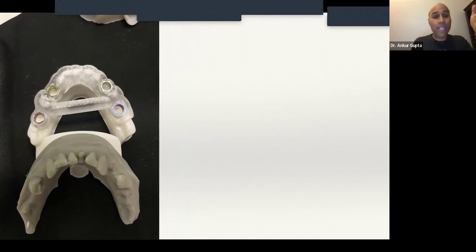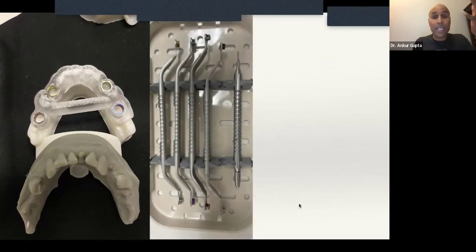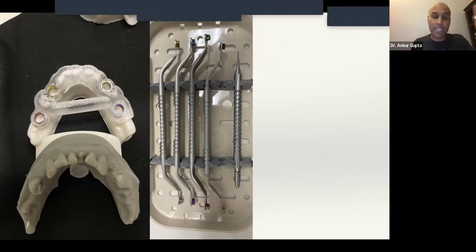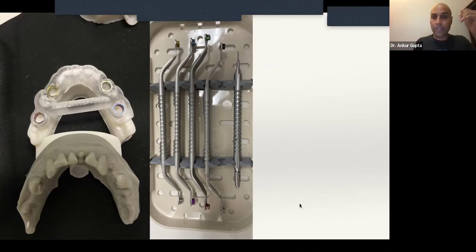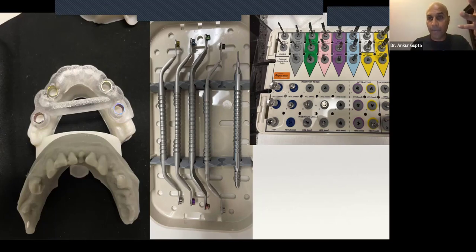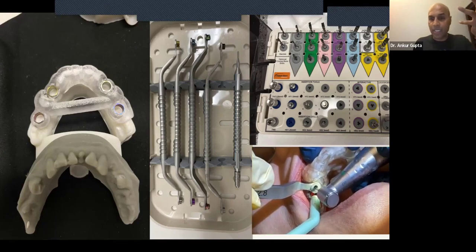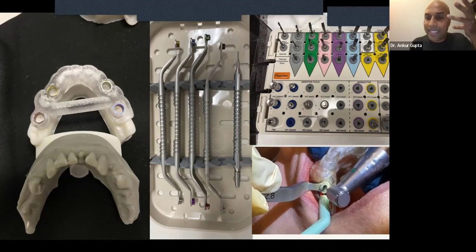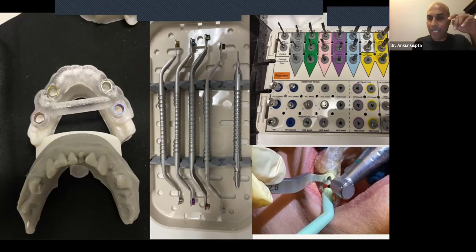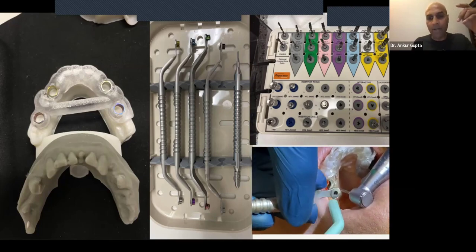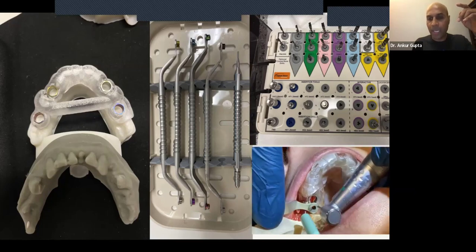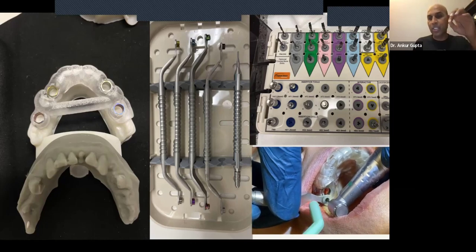My lab tech told me: before you get started, pull a couple of these teeth so the guide will actually fit. Then when you snap it on, this thing serves as a guide telling you exactly where to place each implant. I don't even have to be smart — I get the patient numb, lay a flap, use the surgical guide along with the keys from the Implant Direct kit, stick those keys into the surgical guide, and I'm literally placing the drill exactly into that key so it goes exactly where the implant is supposed to go. I don't have to use my brain — all I have to do is get that key in place, step on the gas, and I'm putting osteotomies in the exact spot where they belong.